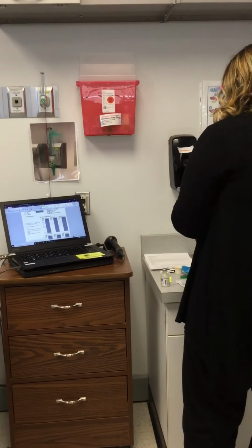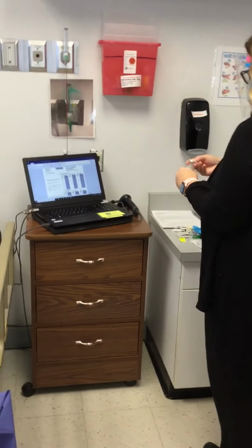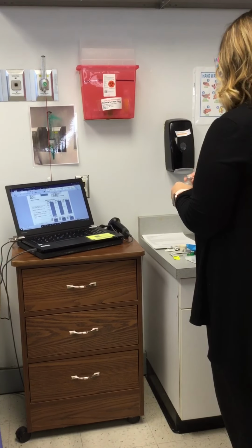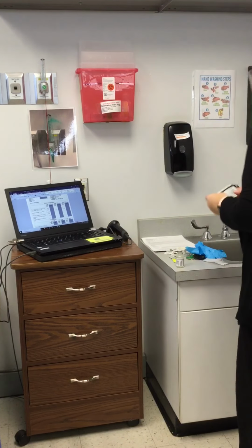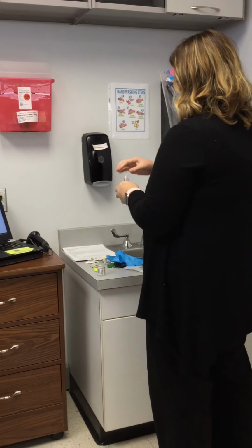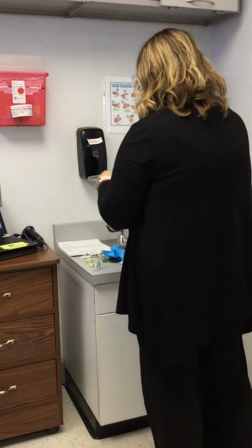So I'm going to take this out. I'm going to scrub the top of the vial for 30 seconds. Once my 30 seconds is done, I'm going to open this up, remembering that it's sterile, so you want to be careful not to touch any of the connecting points.